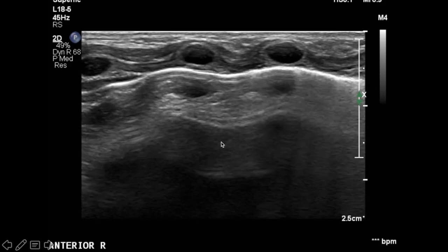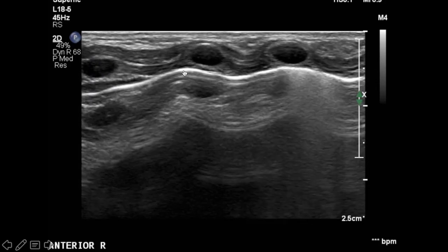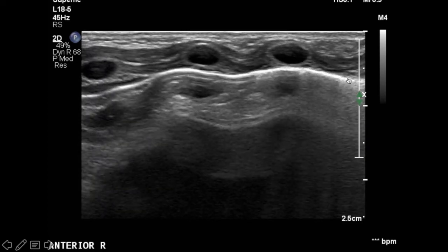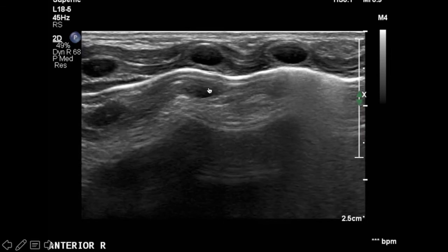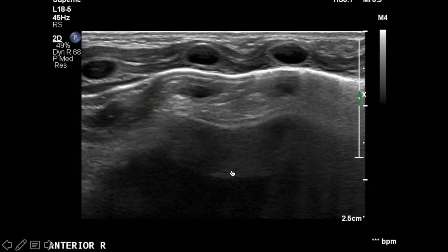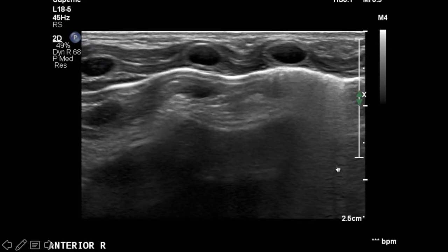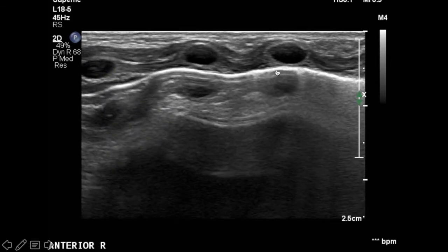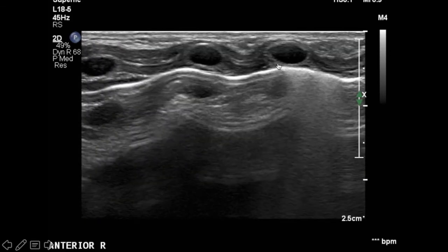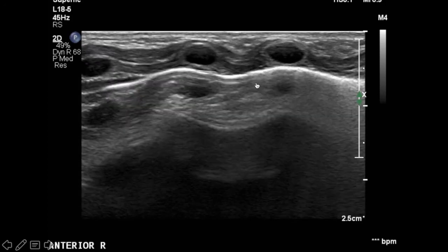This is an example of a pneumothorax. You can see here the pleural line is not sliding, when here it is sliding. You can see the difference. There is only A line here, here, and here. And there's no B line here, whereas you have a lot here. And you can see that you have a separation here between this part of the lung that is sliding. This one is not sliding. This is your lung point.